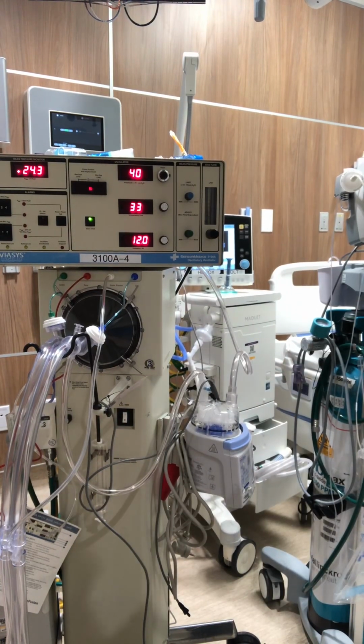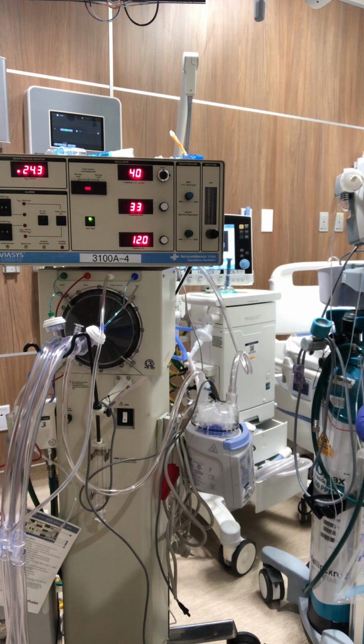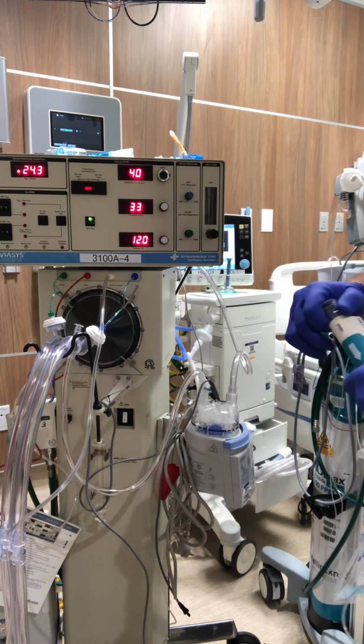Alright, so now we're going to add nitric to the oscillator while it's currently on a patient. I know this can be kind of intimidating, but we're going to walk through it real quick so that it's not as intimidating when the time comes to actually have to do it. So starting with the basics, right?